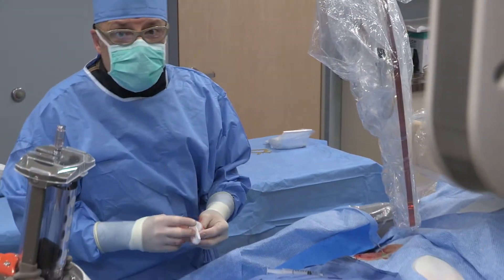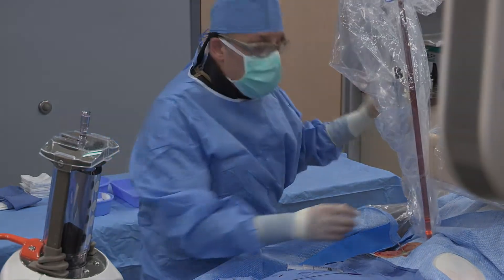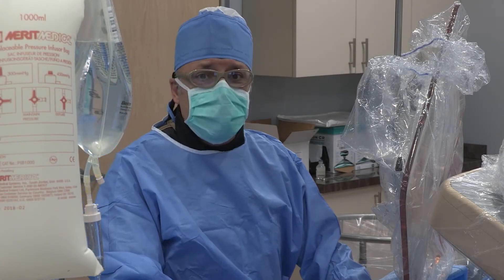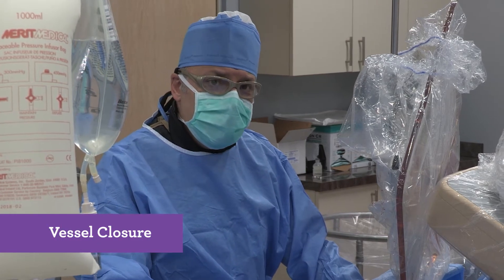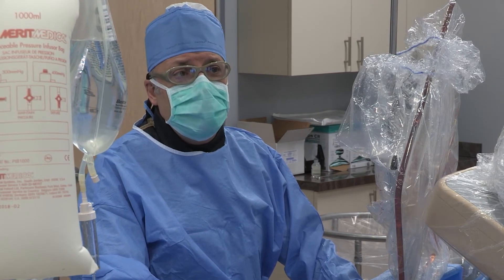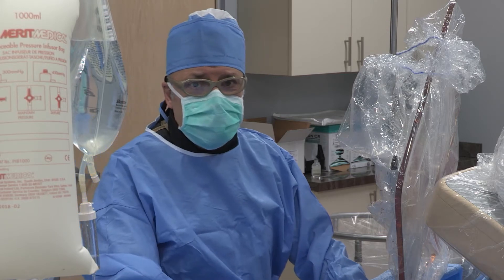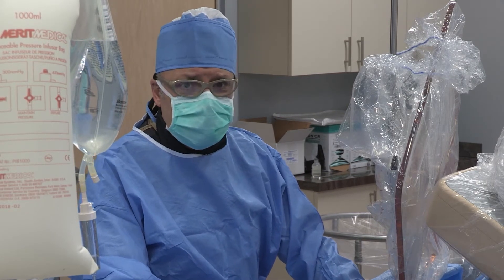Now we have the sheath in place and will proceed with the procedure. We will come back when we are closing this artery. The patient underwent atherectomy of the left superficial femoral artery with Silverhawk technology, followed by drug-coated balloon angioplasty with a crossover technique.